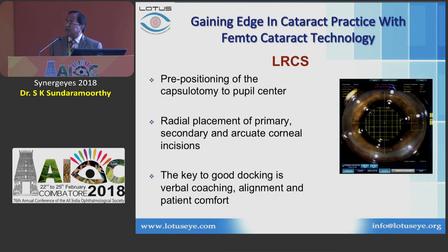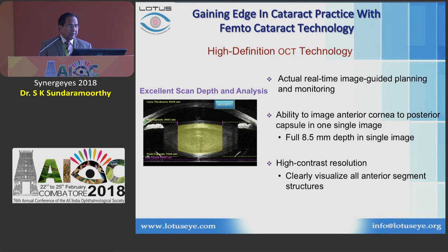Good docking, and in any patient, when you are operating under topical anesthesia, you are verbally coordinating with the patient and guiding the patient to focus on you. Look at this OCT technology. OCT takes you from the front part of the cornea to the posterior capsule, 8.5 millimeters, in a single image. It's great. And it's an actual real-time image, not already recorded. It's real-time image guided planning. And you get a resolution, the contrast is very good. You can see all the structures very clearly.